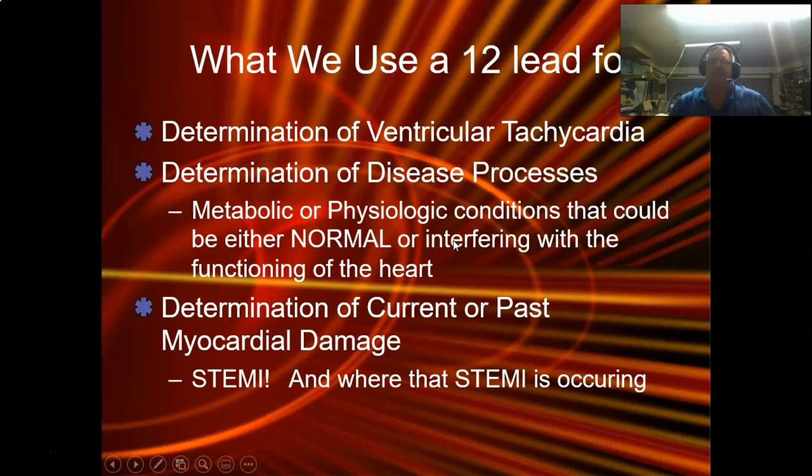And a good example of that would be when you've got an inverted T wave during your QRS complex. It reads the QRS because there's a lot more voltage that it can read versus what just the atria are doing. There's a lot more muscle, therefore you're going to get a stronger signal, which is why you get waves that are buried in those QRS complexes or buried maybe within a T wave that you can't see, simply because, again, the machine is designed to pick up the strongest electrical signal.